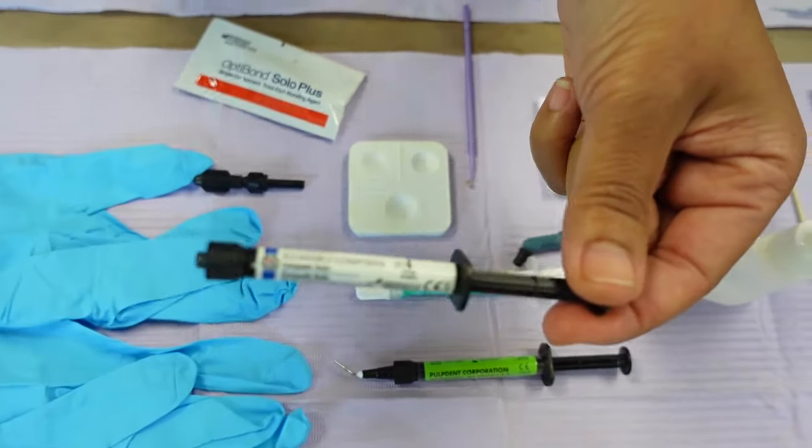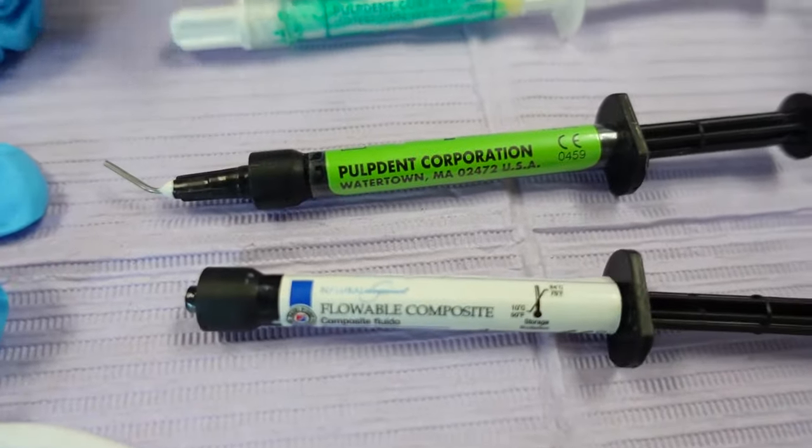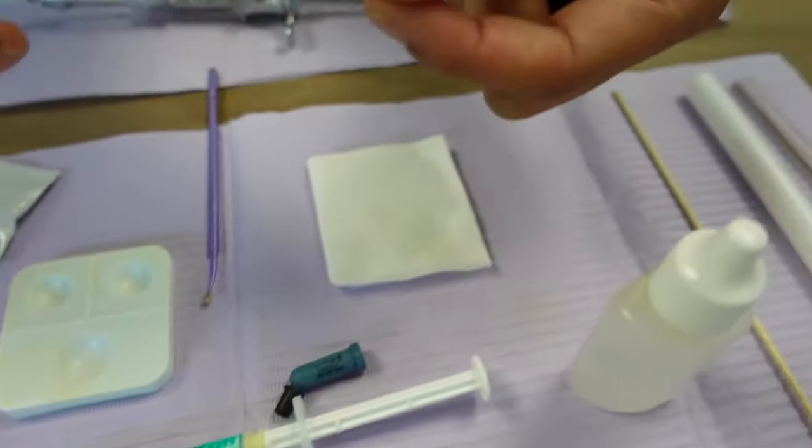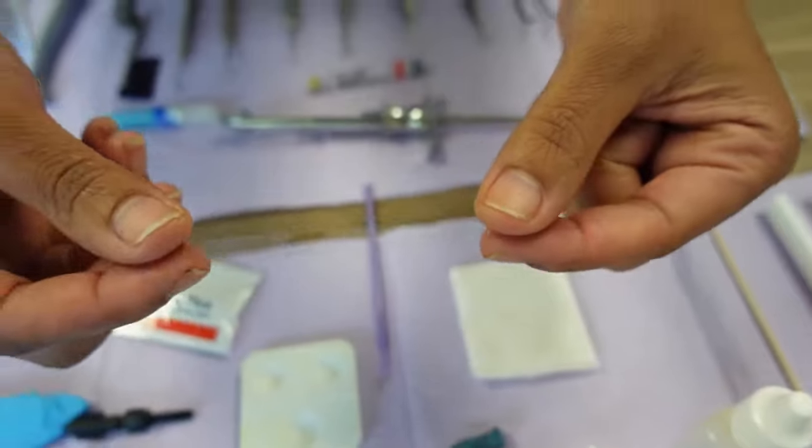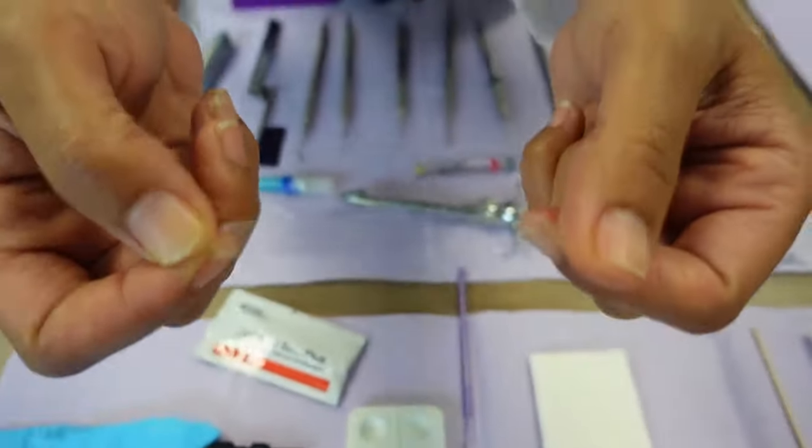Next we have a mylar strip. It's very clear. It goes in between the tooth, especially anterior. These are used on anterior teeth.